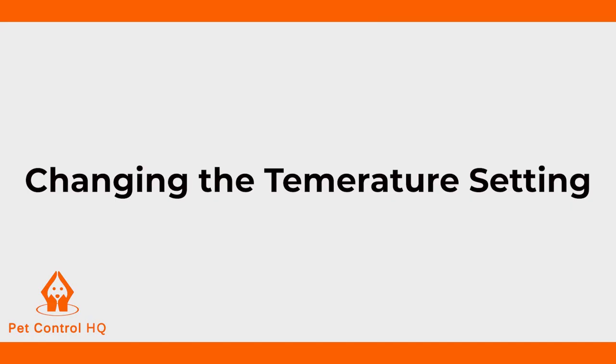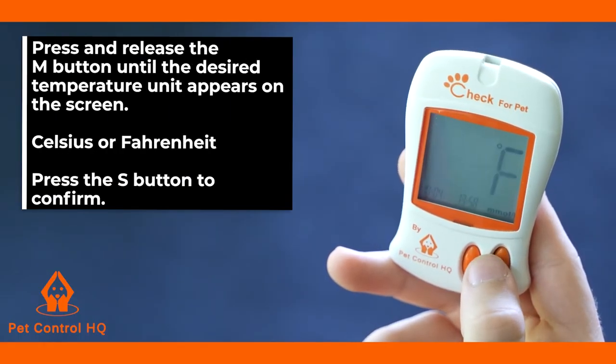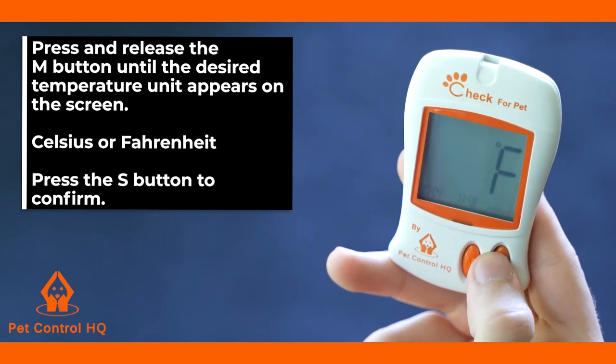The temperature setting will then be displayed on your monitor screen. To change the temperature settings on the screen, press and release the M button until the desired temperature unit appears on the screen — degrees centigrade or degrees Fahrenheit. Then press the S button to confirm.